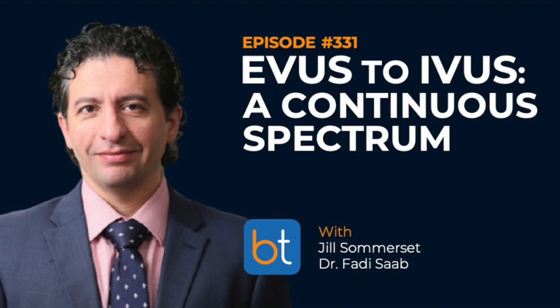That's a critical point. Number one, for the physician to tell the ultrasonographers, stop the rocking motion, because that's how they're trained. They have to have a rocking motion. That's the proper way of doing it. And then it took me 6 months when we first started doing this to say, why are you moving back and forth? And they're like, what do you mean? That's the way we're trained, right? So it's pearls like this that only these guys know how to relate to others. I would love to hear a talk like this, just teaching ultrasonographers how to do it. Fantastic. I think we can make that happen.